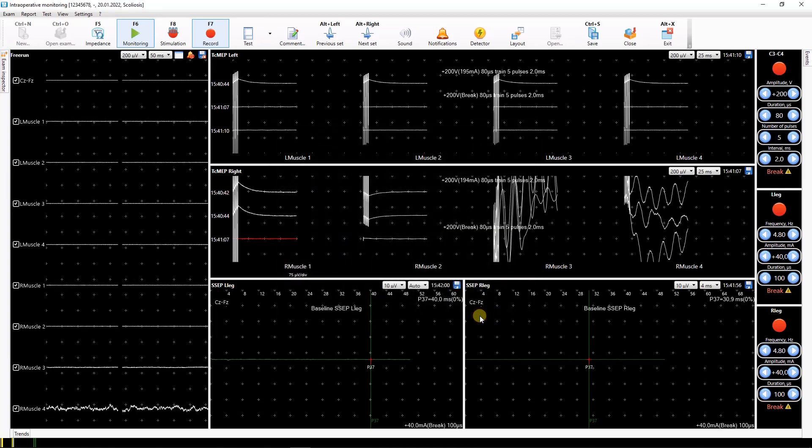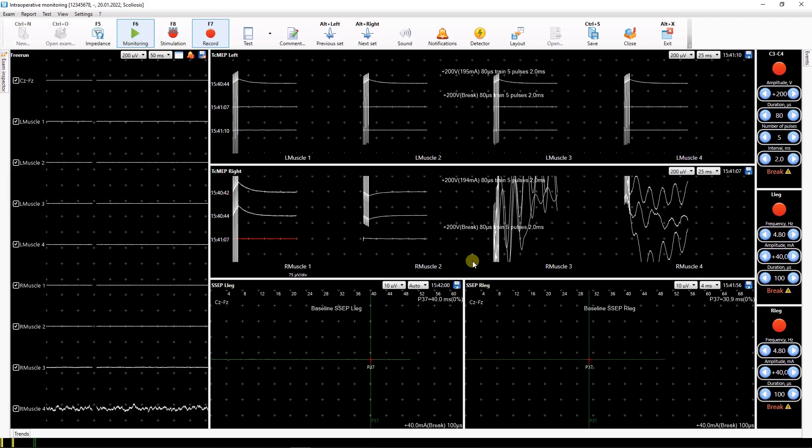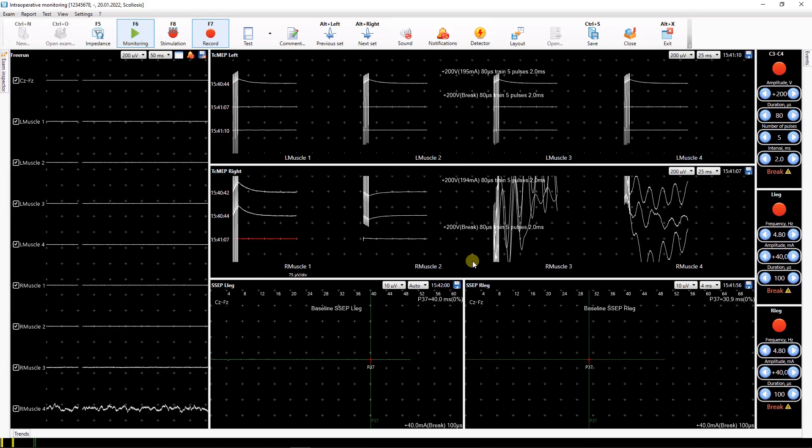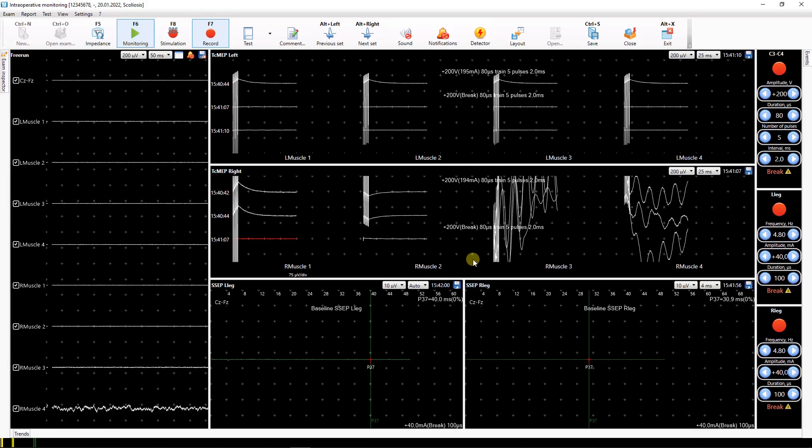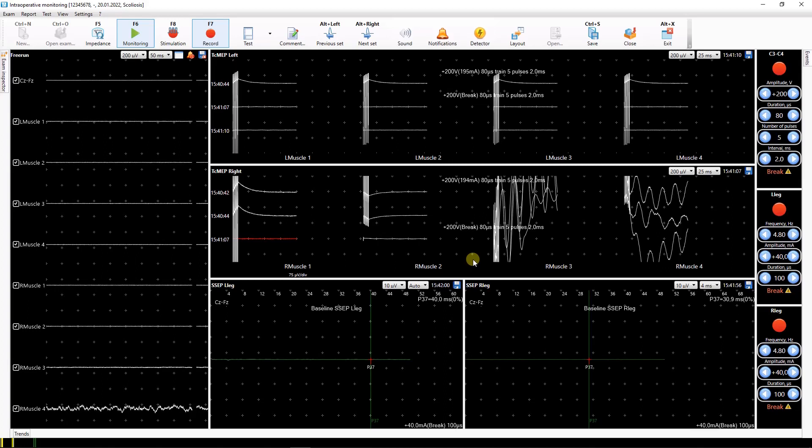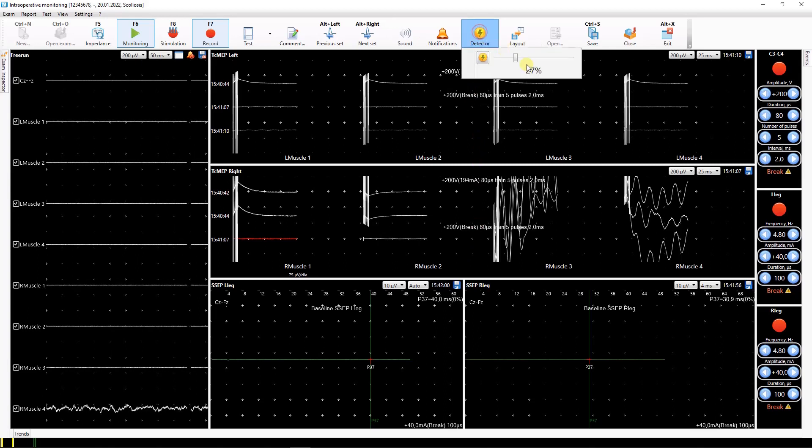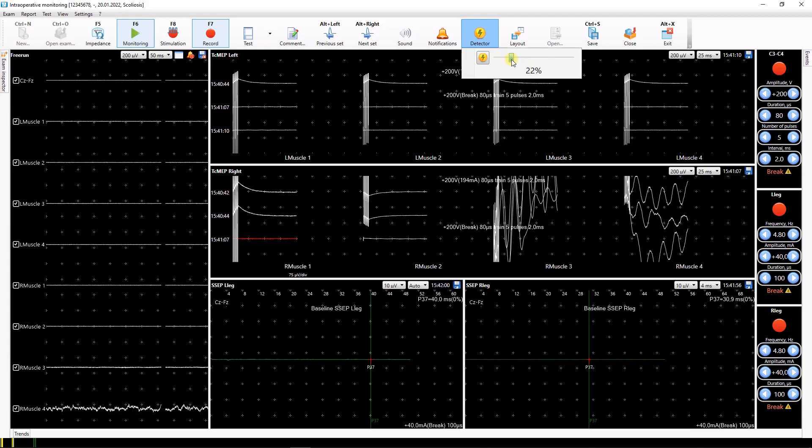If electrocautery detector clip is connected and the surgeon is using electrosurgery device, the icon lights up in the toolbar. At the same time, stimulation and sound notification are paused. If necessary, you can adjust the sensitivity of an electrocautery detector using the slider. Here you can turn off the detector at all.